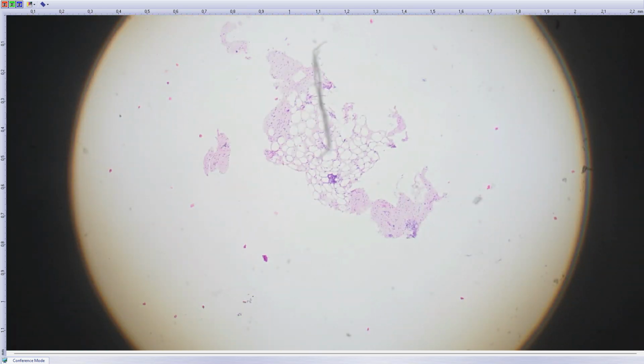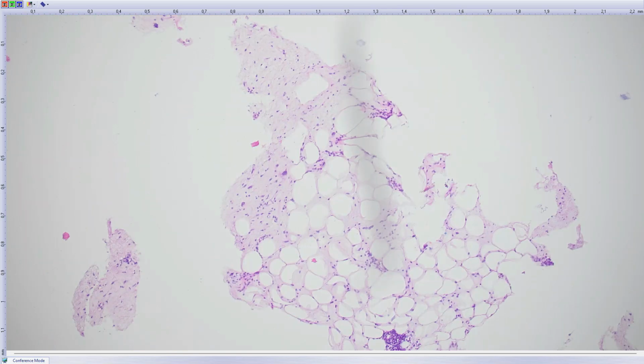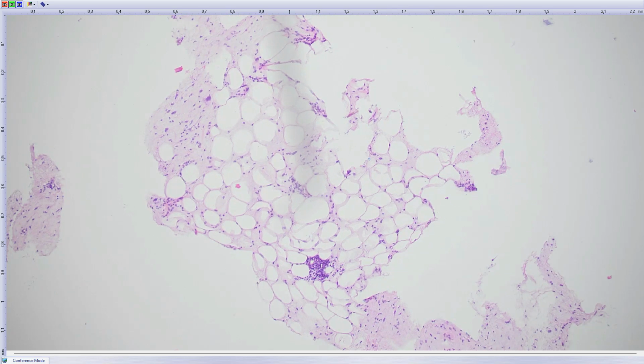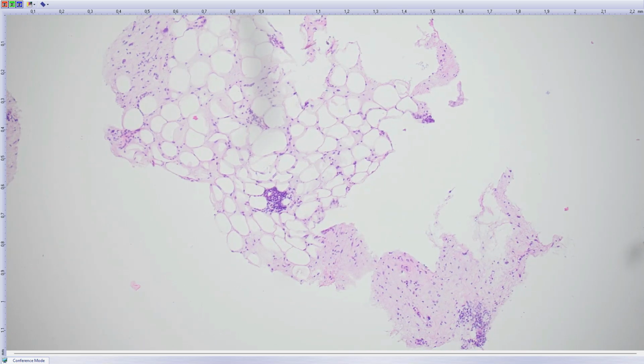Good afternoon, it's Michael Jr. here. I have an easy case to start with. It was a 47-year-old female, again a retroperitoneal nodule, and we had this tiny little piece of tissue, and again it's from the retroperitoneum, not an old person, but 47 is on the older side, let's say.